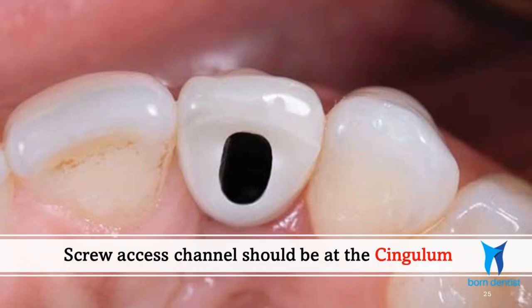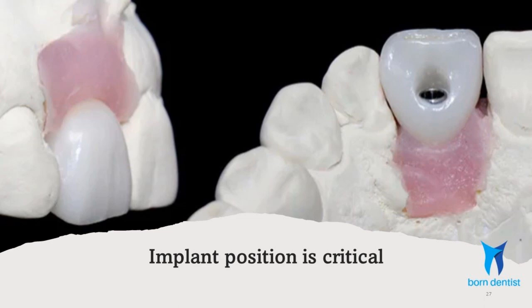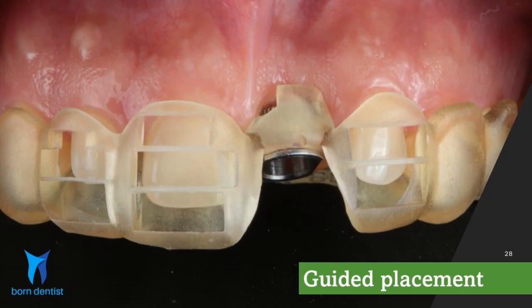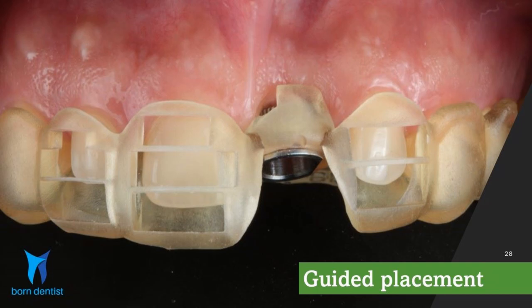When choosing a screw retained crown on anterior teeth, the screw access channel should always be at the cingulum of the restoration for aesthetic reasons, otherwise it will be an aesthetic disaster. In order to achieve that, implant position is crucial, so a guided implant surgery is indicated in the aesthetic zone to get the implant position accurate.